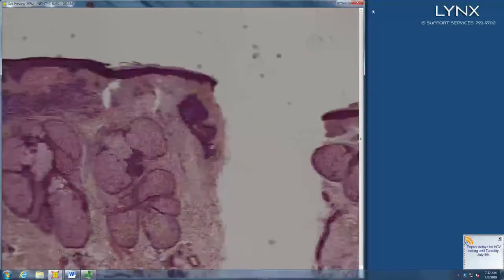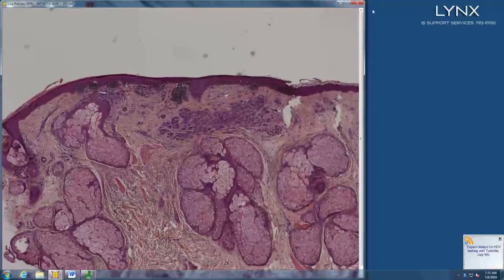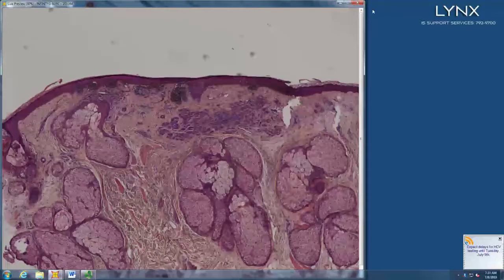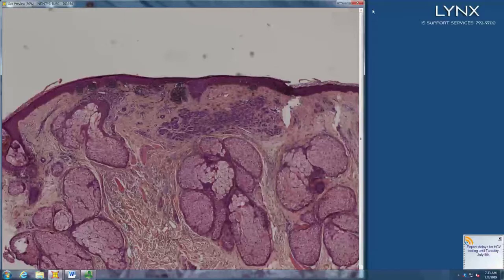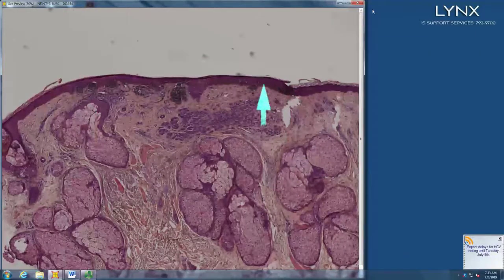So we're on pretty sebaceous skin, probably like on the face. Yep. I think there's a melanocytic proliferation in the upper dermis, and maybe a little bit in the epidermis as well. So there's definitely melanocytic proliferation that looks fairly bland, a zone of fibrosis, and then a junctional proliferation that in some areas is nested, but in other areas not at all nested.